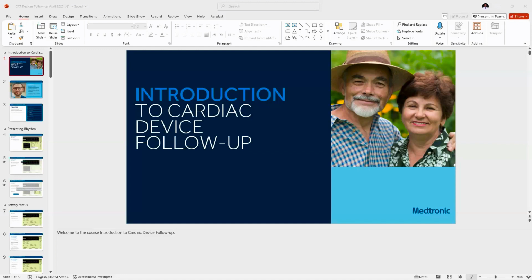So when doing the manual test for the threshold, you still come to this icon of the test in this window, click on the threshold, and you're able to do the threshold test from here. Amplitude decrement, the chamber, the ventricle. You can choose DDD, you can choose VVI when you're testing the ventricle at a rate of 90. And then you can start at 2, 3 volts, 3.5, depending on what guides you, which is the data that you've seen in that quick look screen that has the auto capture management data.